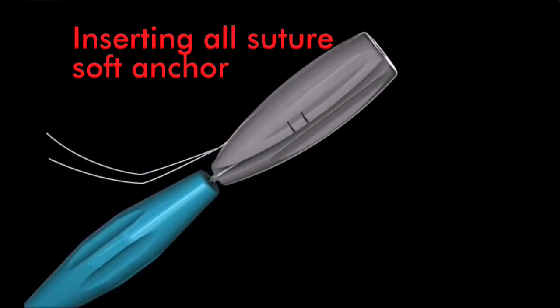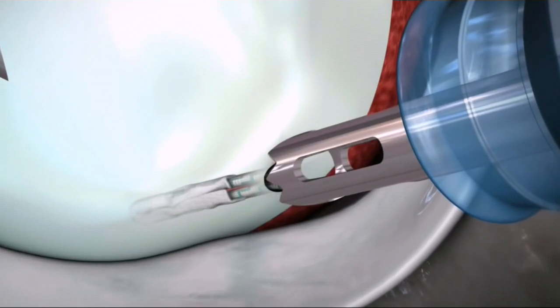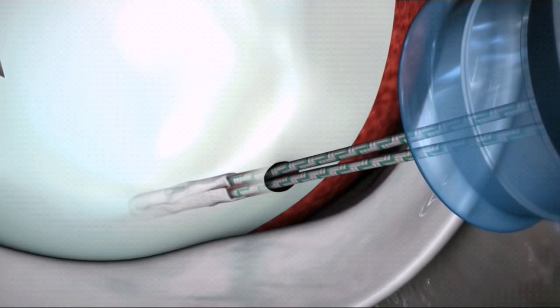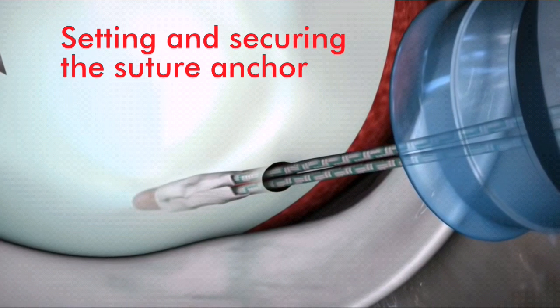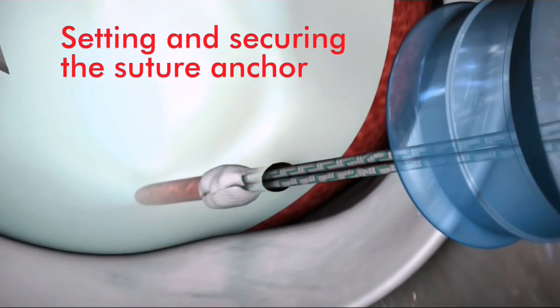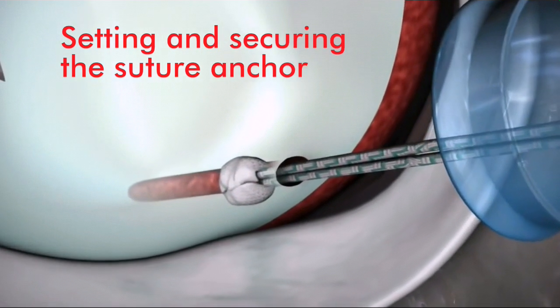Release the suture from the driver cleats and remove the driver and drill guide from the joint. Pull on both suture limbs to set the anchor. The soft anchor will compress, expand laterally, and form a 360-degree fit within the pilot hole.